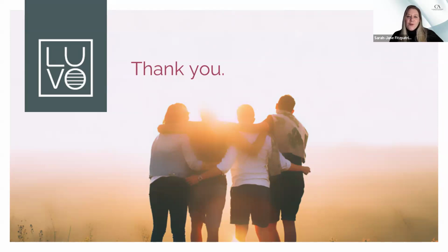Thank you. And just to follow on with the P settings you were talking about, can we use the P2 settings that are programmed into the machine, or are those not as effective as the settings in the parameter book? Well, in the parameter book that you have from this webinar, it will say P1 and P2, and that's for skin types 1 and 2. For skin type 3, you use what's in the book. But remember how we talked at the beginning about a skin type 2 becoming a 3? Well, a skin type 3 can become a 2 if they have had no sun exposure. You're hitting February, and wherever you are in the world, if you're going through winter, it's minus 30 where I am right now.